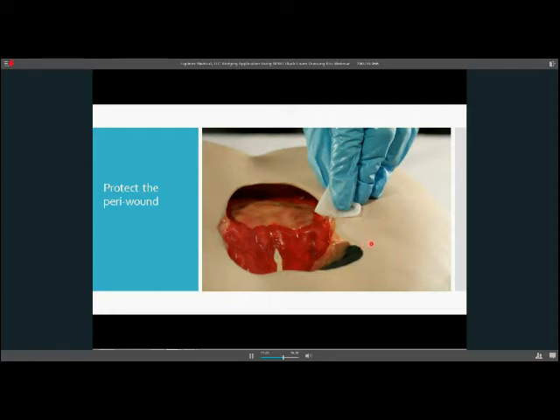At this point, I'm a big person on window painting, sort of protecting the outer areas over here with a little bit of transparent drape or something. Again, your facility may use something to window pane.